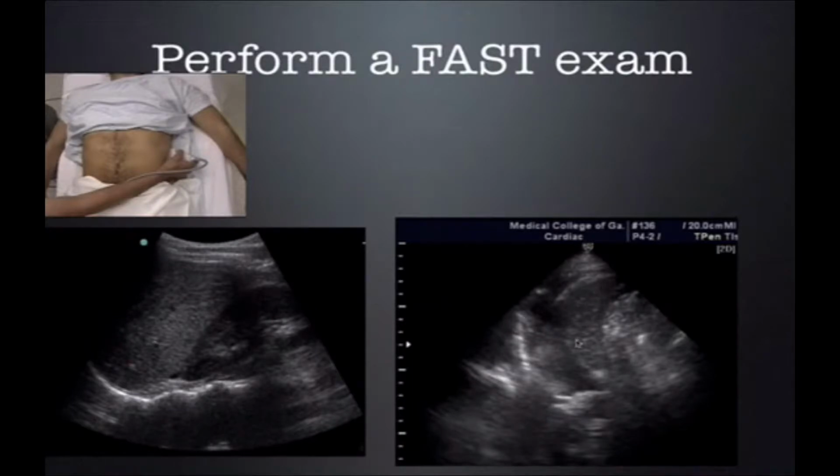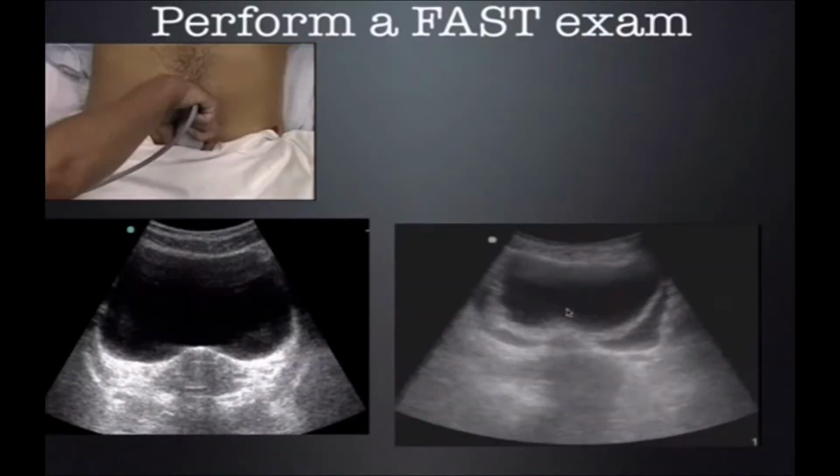Here's a positive finding. Here's the spleen. Here's the diaphragm. Here is free fluid, between the diaphragm and the spleen. This would be a FAST positive case.